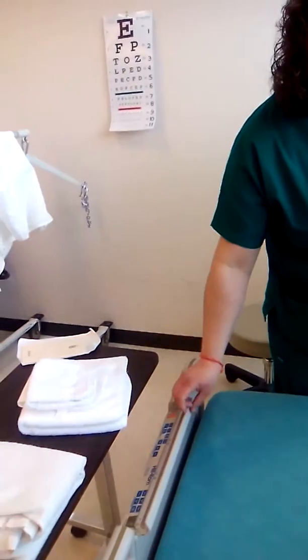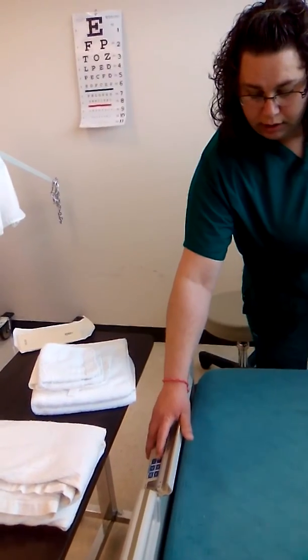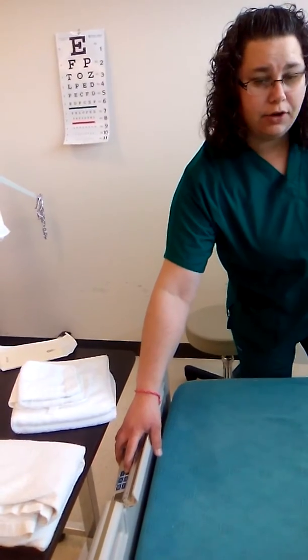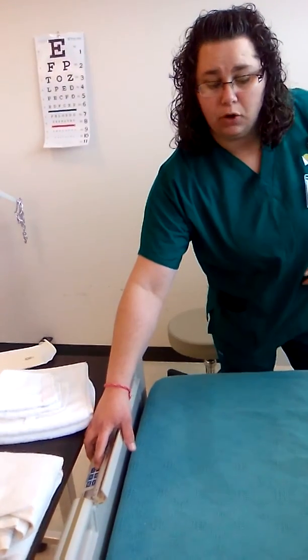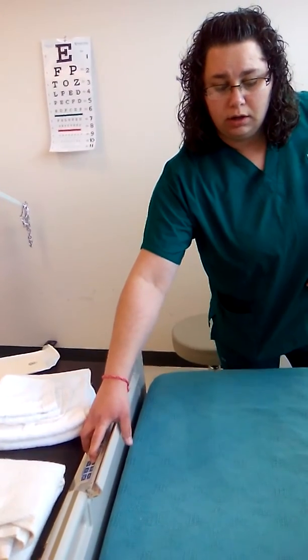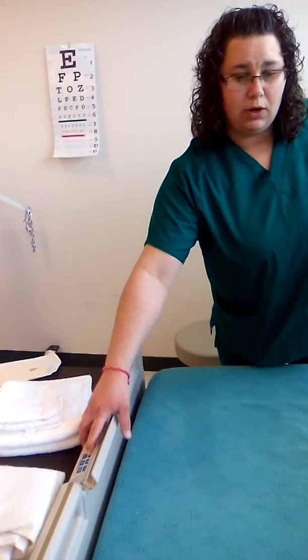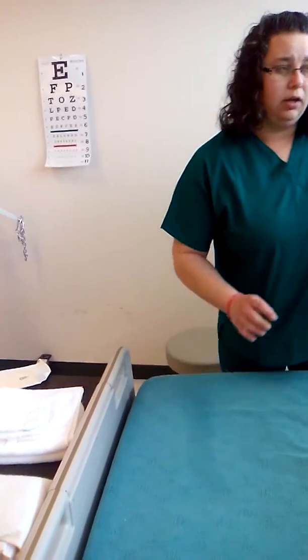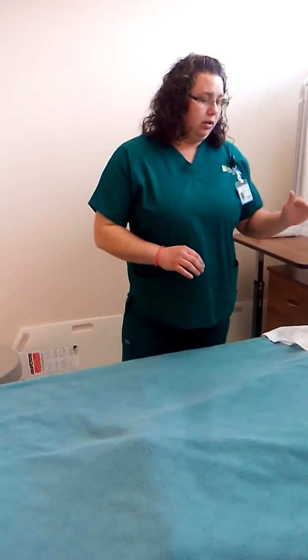I am going to ask the patient their knowledge of catheterizations, and I am going to note their feelings about it. I'm going to perform hand hygiene again. I am going to apply my gloves.